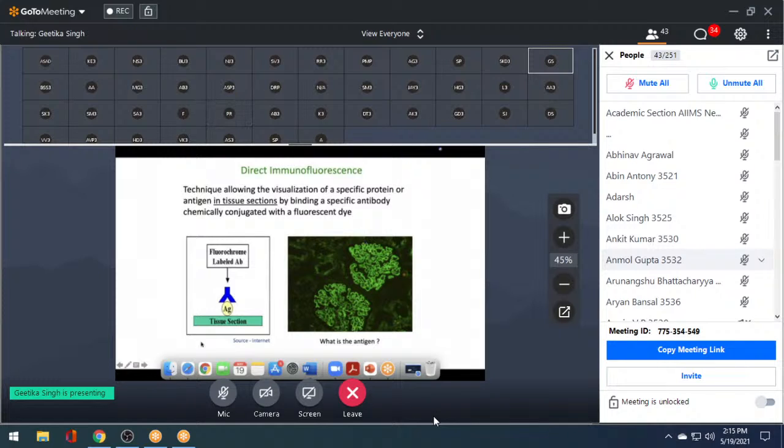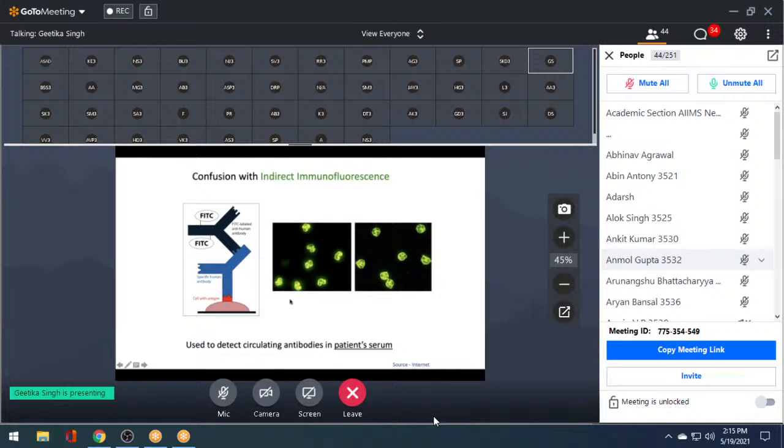So my so-called antigen of interest, when I am looking at kidney biopsies and trying to reach a diagnosis, is not what you would truly call an antigen. What I'm actually looking for is the antibody and the complement component of that immune complex. So if I have a post-streptococcal GN that I'm trying to diagnose, I don't go looking for the streptococcal antigen. I will look for the immunoglobulin and complement response to that antigen and come to a diagnosis. So the antigen is in a way actually an antibody or complement component.